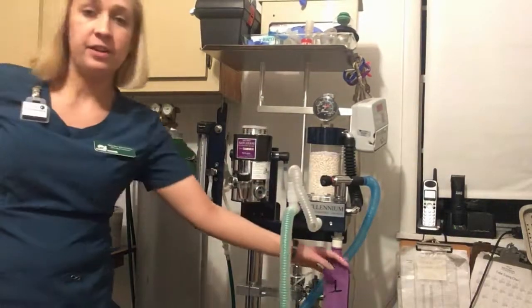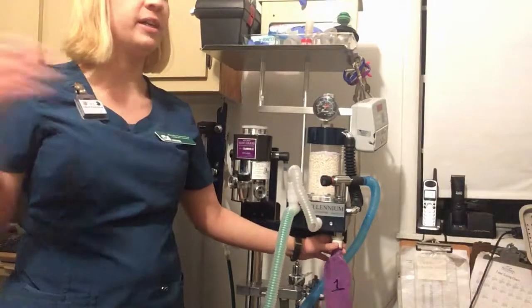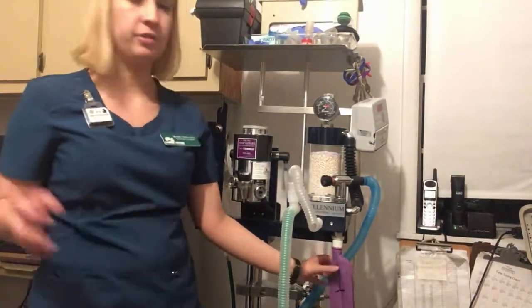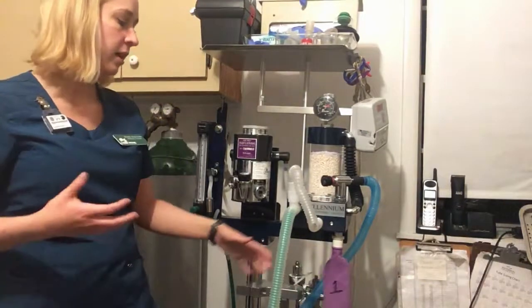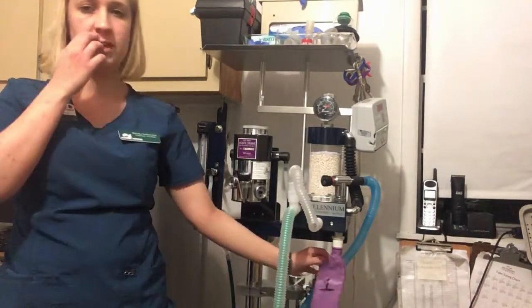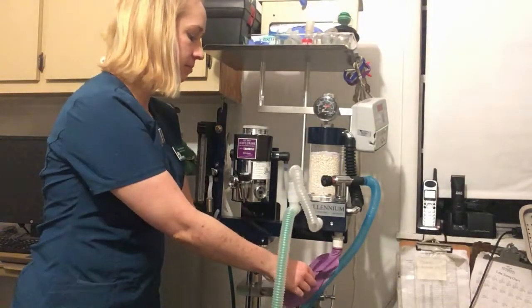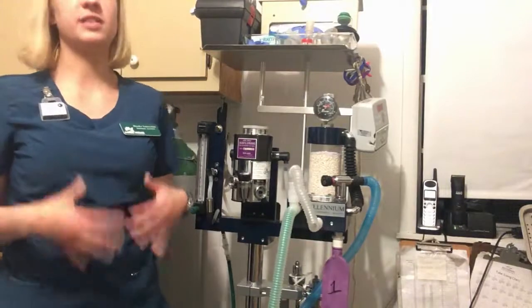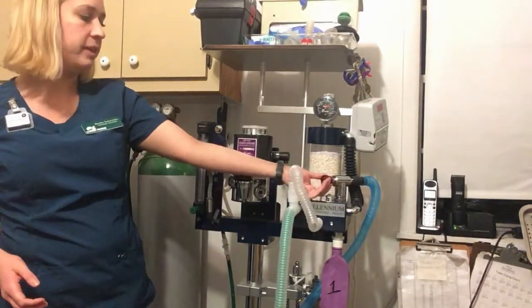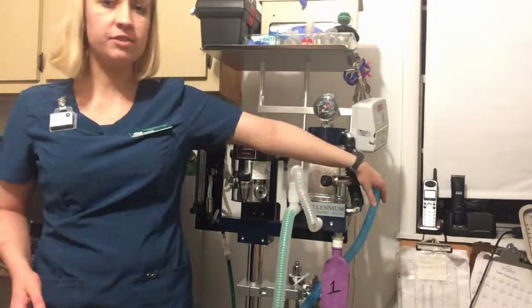The next part we have here is our reservoir bag. This is kind of like their lungs, which helps move everything through the system and hold the excess air as well. A good judge for getting the size for this is based off of how big the size of their lungs is. So this here is the pop-off valve. It can be opened or closed. Then this goes on to our scavenging unit.